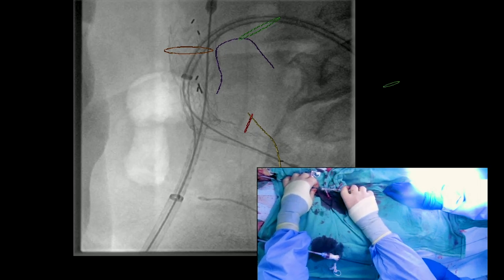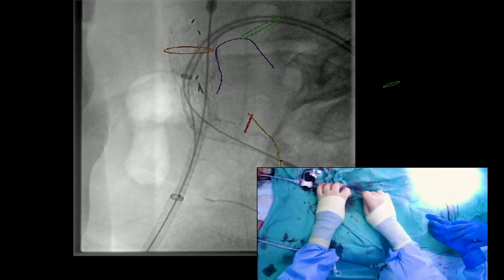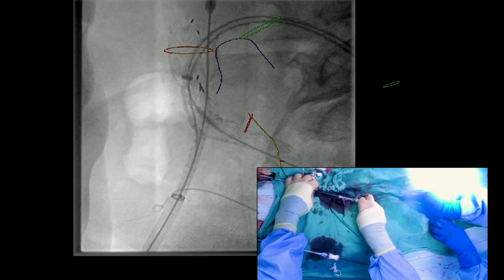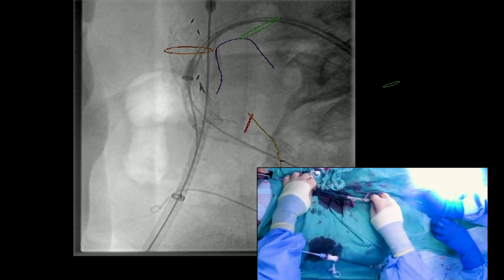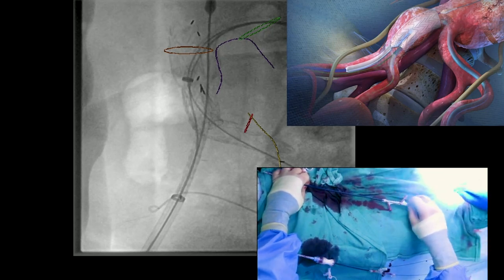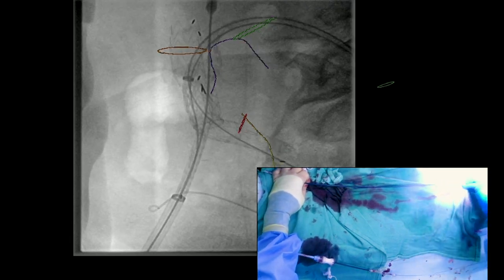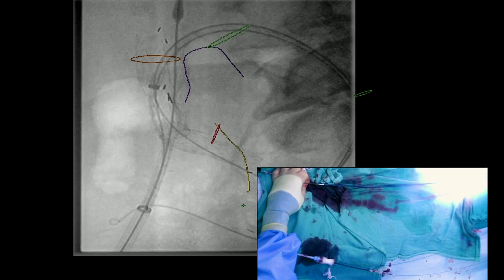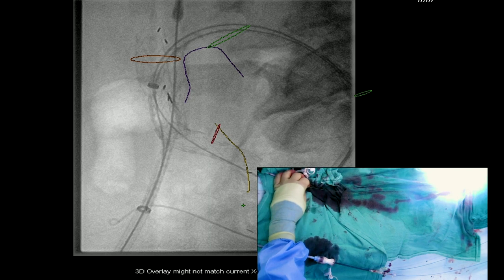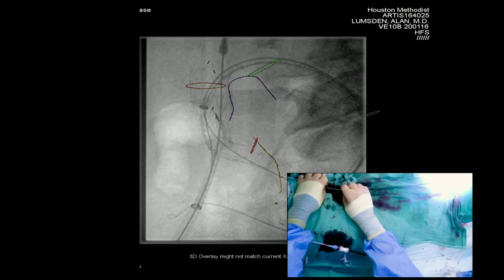The next step is to retrieve the delivery system through the left groin, making sure we're not losing the Rosen wire. The delivery system is coming out and we'll replace it with a 12 balloon. The insert schematic shows what we've just done — we've deployed it. Now we're going to bring up a balloon and place it first in the seal zone, then inside the internal iliac, and then in the area of overlap with the IBE device.